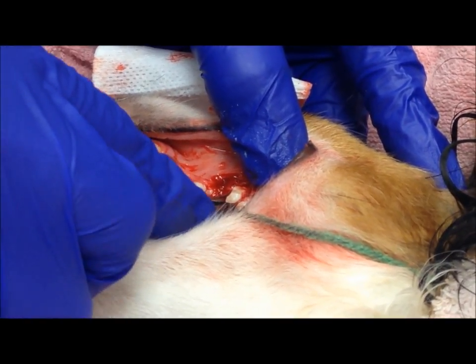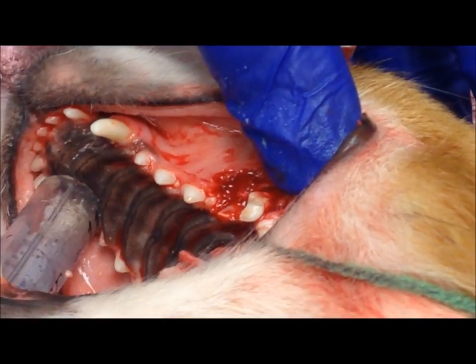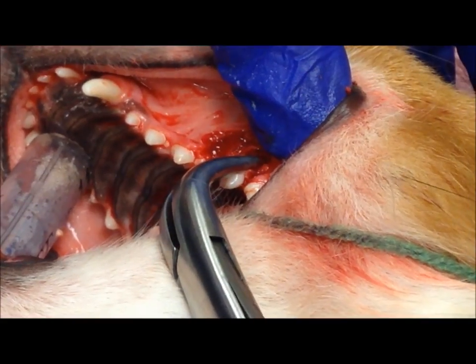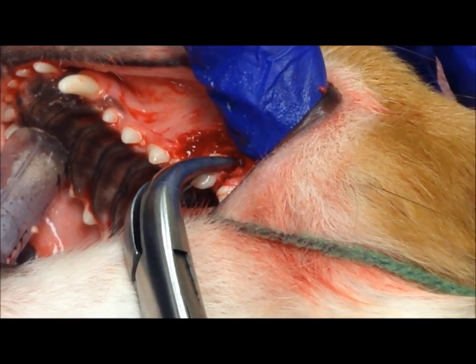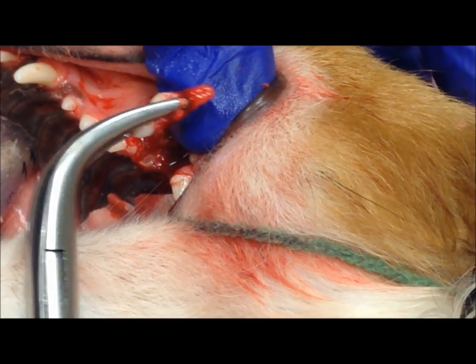I'm luxating the largest root, or distal root. There, it's nice and loose. Grab it with the extraction forceps. There it comes — the root is intact.